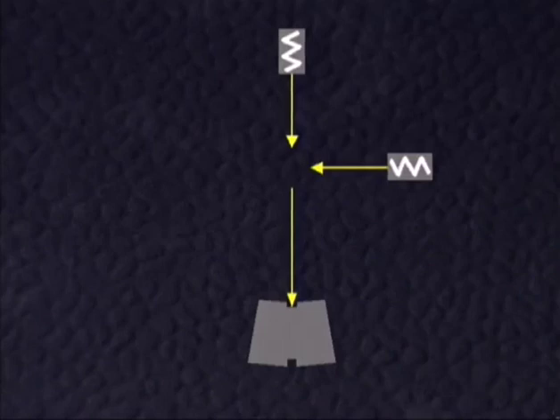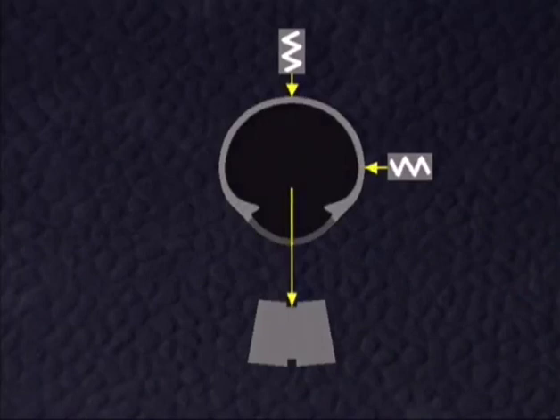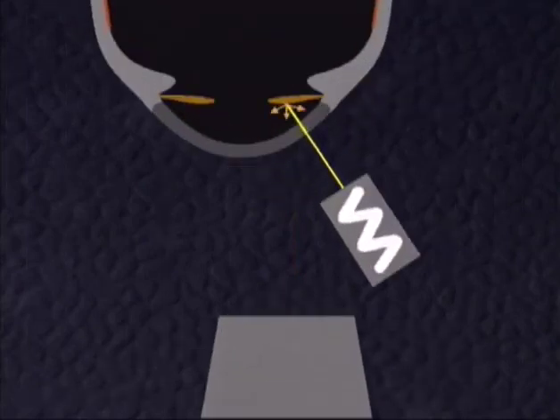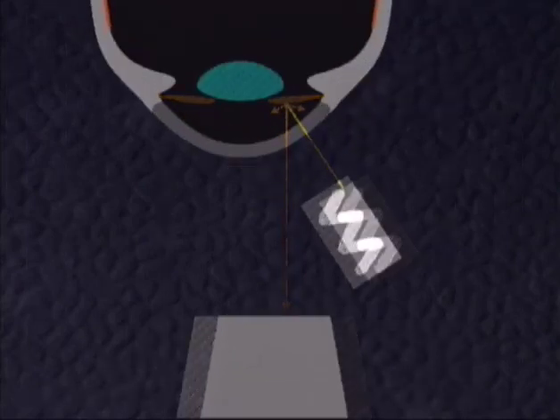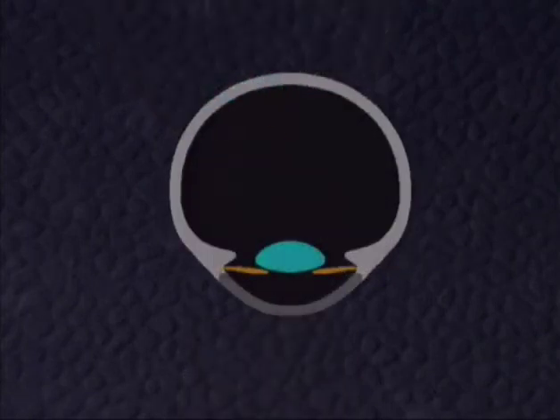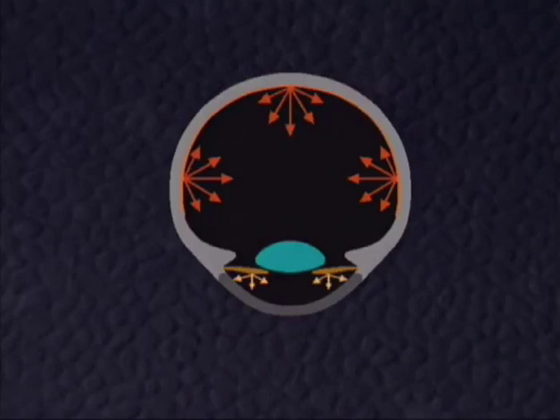Not all angles can be obtained by direct illumination due to anatomical constraints. If direct access of the light to the target is impossible, one has to use indirect light produced within the eye. This is achieved by projecting light against a non-transparent tissue such as the red fundus, which then acts as a reflecting screen. Other sources of indirect light are the iris and, in some conditions, the lens. Thus, the eye interior can be transformed into reflectors for generating indirect light.